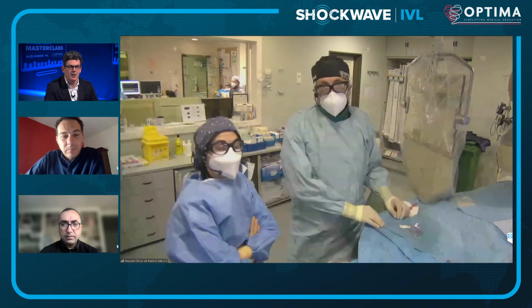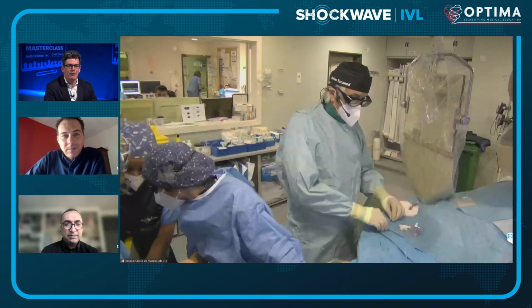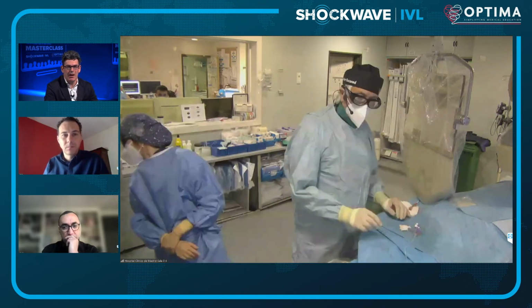Javier, Azeem and Benjamin, I think there would be the temptation here to bring in an NC balloon for high pressure dilatation. But I think we do have access to another balloon, and we can use another balloon. So to avoid high pressure traumatic barotrauma here, I think it should be the aim of this procedure. The safety should be paramount.